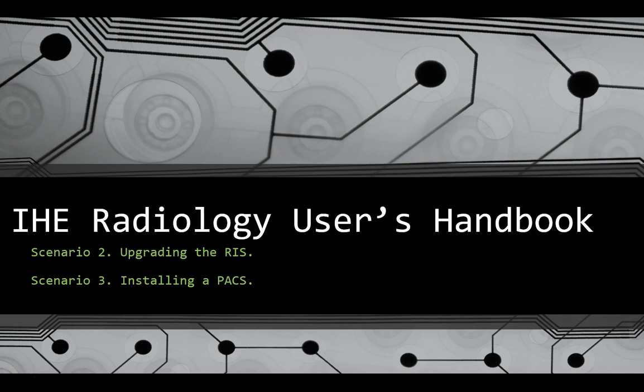completed. The primary function of the RIS will be to process orders, schedule exams, and generate reports, as well as do charge capture for procedures performed and interpretations in the radiology department. The RIS will send copies of diagnostic reports to an enterprise report repository. Again, that would be a HIS.